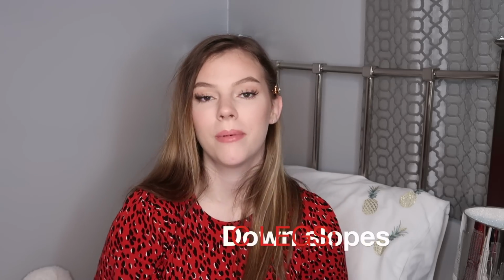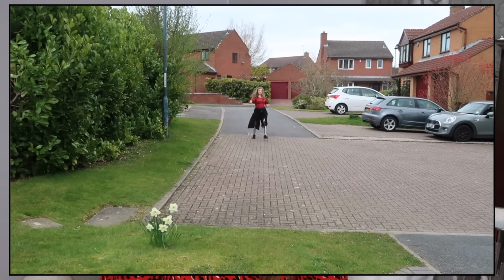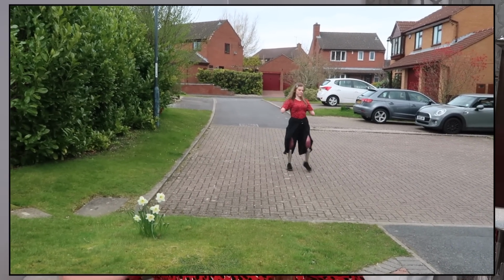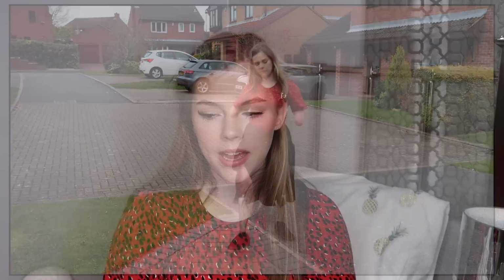Now this scared me so much at first because I thought I was going to collapse, basically. I didn't know how to hold my body, whether to lean back, whether to lean forwards, whether to be straight. And the thing is, you shouldn't, you can't do any of that. With my blades, I would lean back. With these, I don't think I lean at all, really, because I feel like leaning backwards makes them collapse on me.